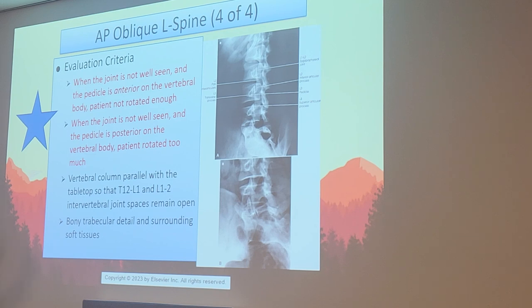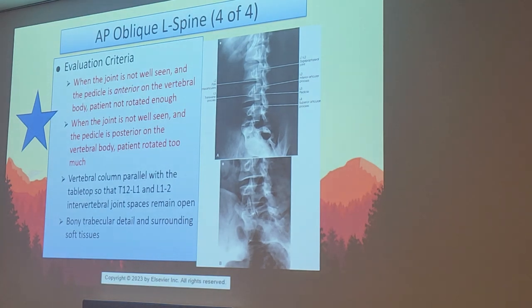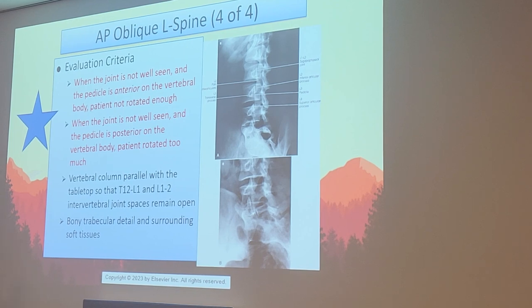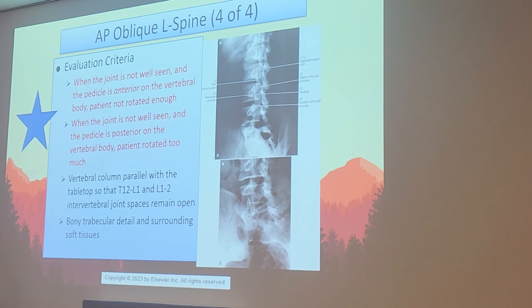On the opposite side, if the joint looks closed off again, but we see the pedicle is posterior, like it's moving backwards, then that means they're rotated too much. Another way you can tell is you look at the nose. We want the nose to be barely protruding outside the vertebrae. If the nose looks really long, like it's coming out really far, they're over-rotated. If it's very central, like it's all the way in the vertebral body, they're under-rotated.